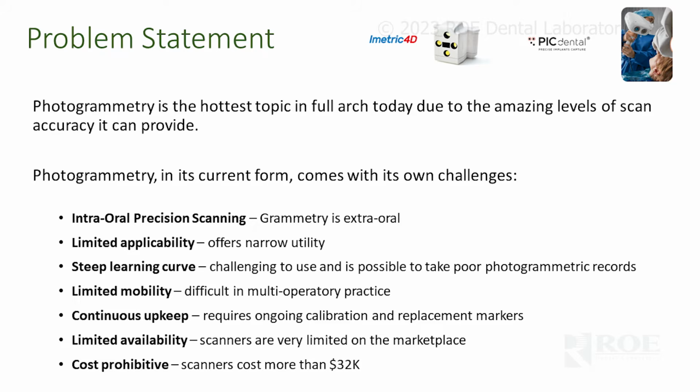I don't like to pick on the product too much, because it's definitely a working, viable solution. We work with this technology every day, and it works very well. But as you can see here, it's cost prohibitive, with limited availability, right? They're generally on back order, hard to get. There is some continuous upkeep with purchasing new scan bodies. The mobility is a little bit of a hindrance too, right? These are bulky and heavy, and you have to oscillate them around the head or leave them stable and move the patient's head around them in surgery.